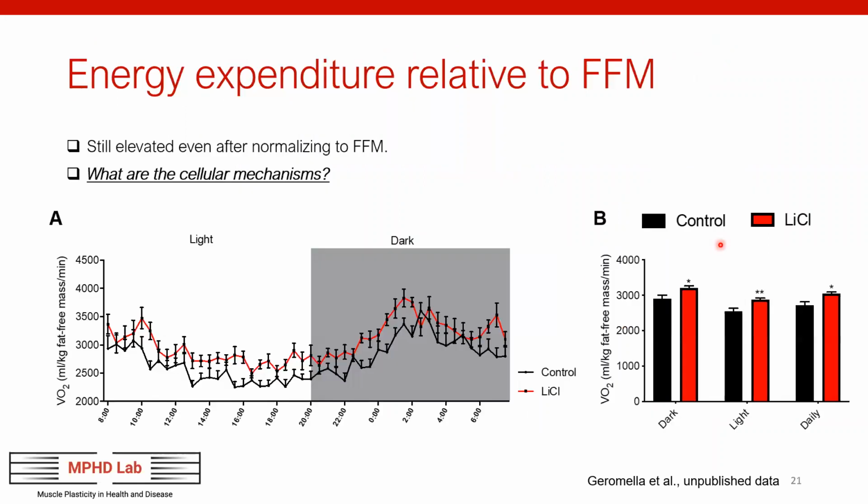And that change in body composition is really important because, as I said, I'd get back to this. Most people will normalize their energy expenditure data, or their indirect calorimetry data, to kilogram of body mass. Some may argue that normalizing to fat-free mass is more accurate. And so we are able to do that now because we have this system on hand. So we're able to couple the metabolic cage data with the small animal DEXA data, which is really strong for us in our field.